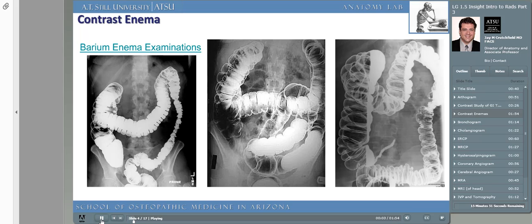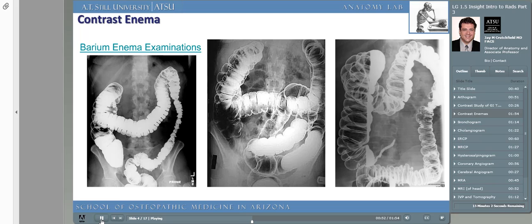Here we see an example of a contrast study of the colon, called a contrast barium enema examination. Like the upper GI series, the barium enema exam can be performed with barium and/or gastrographin. The examination is performed with either a single column of contrast material — a single contrast barium enema — or with fluoroscopy of the colon partially evacuated of contrast and then re-insufflated with air, called a double contrast barium enema. A double contrast barium enema is the type most commonly ordered by the physician.